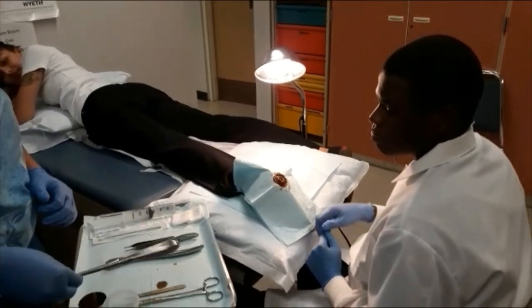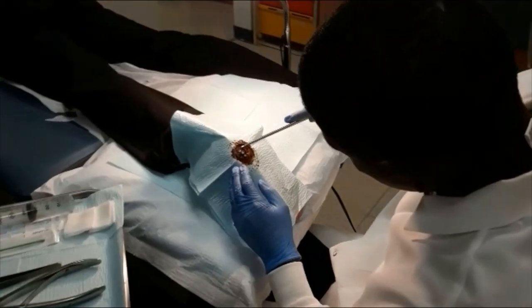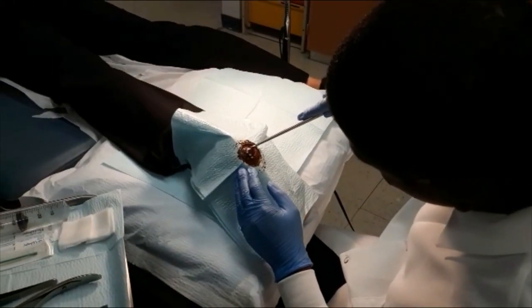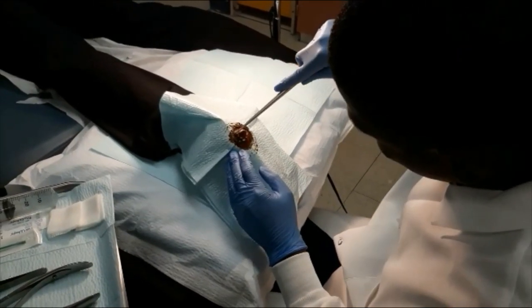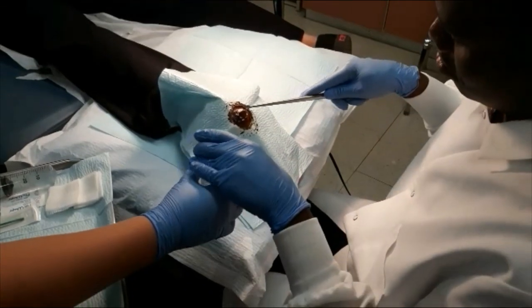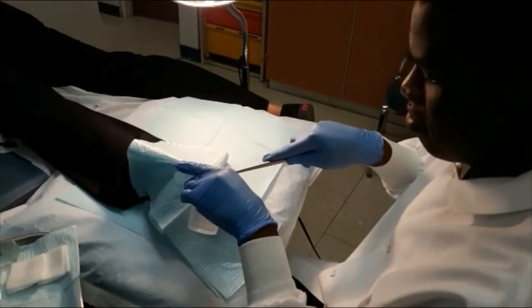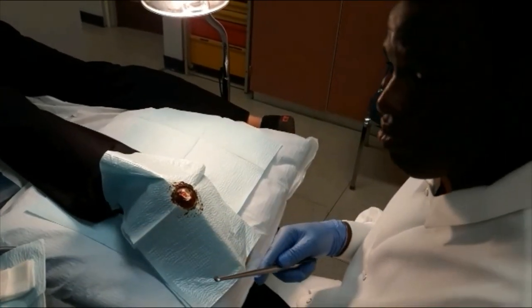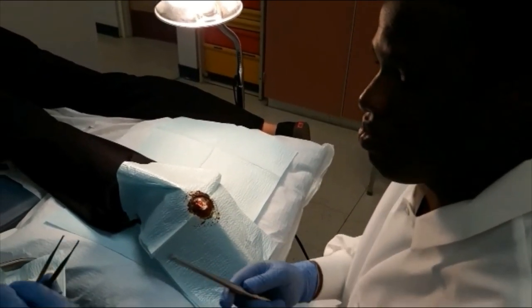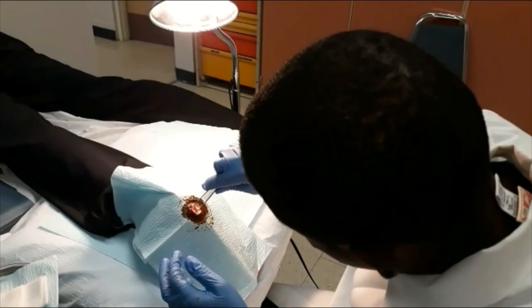Next, a curette is used to scrape and scoop out the wart down to its deepest visible layers. The tissue forceps are also used to remove any loose pieces of wart.